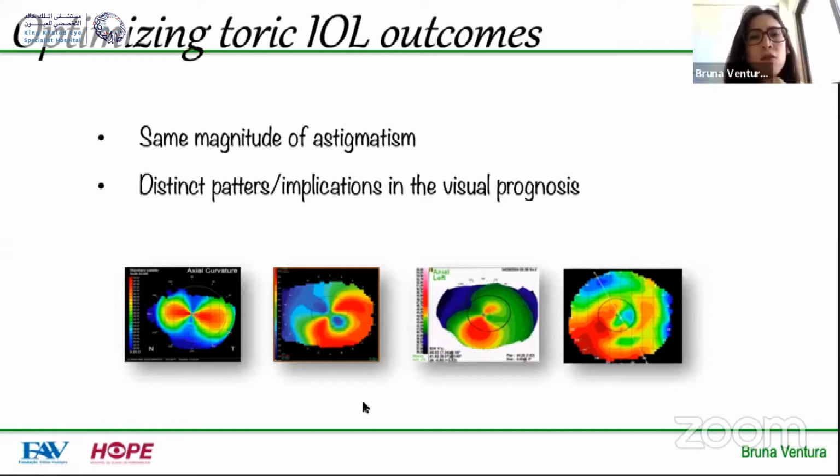It's very, very important for us to be combining the results from our biometer with a corneal map. And it's very important not only for us to know how precise and accurate the number that's been measured is, but also to know what the real implications of that cornea are with regards to how precise our measurement is, and what the patient should expect with the visual prognosis, with regards to vision and the surgery. So let's say a patient has a corneal ectasia, a patient has keratoconus.